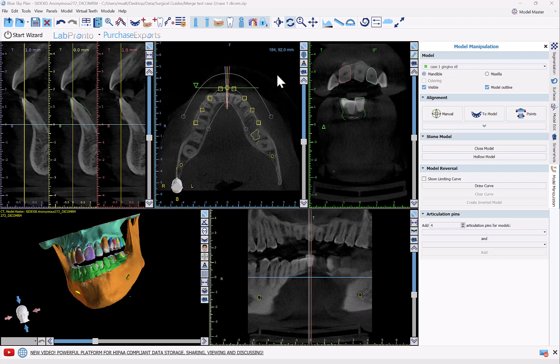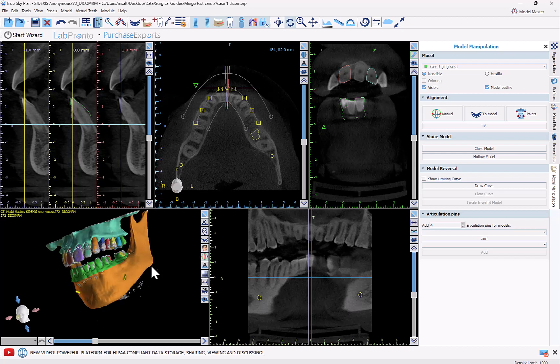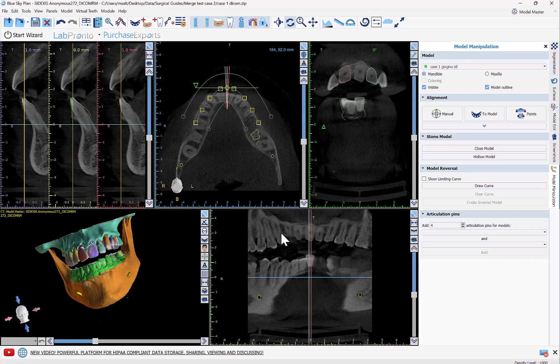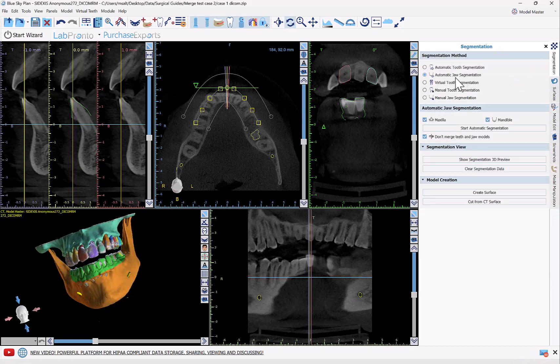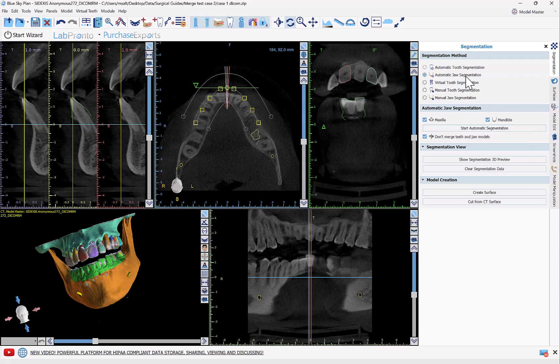This is a very quick video on how to extract multiple teeth from a model while retaining the emergence profile of the teeth. What I've done right now is segmented all of the teeth from the CT scan using a fantastic new automatic segmentation functionality to segment the CT teeth and the jaw completely automatically. You can do that simply from the segmentation panel by clicking 'Start Automatic Segmentation.'